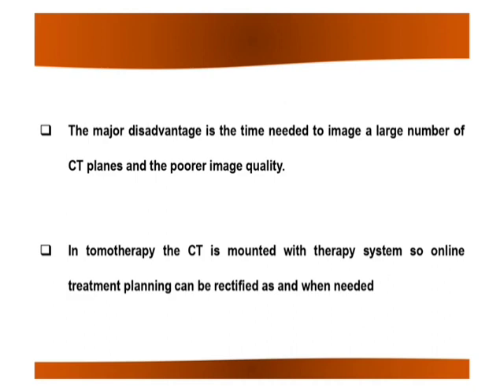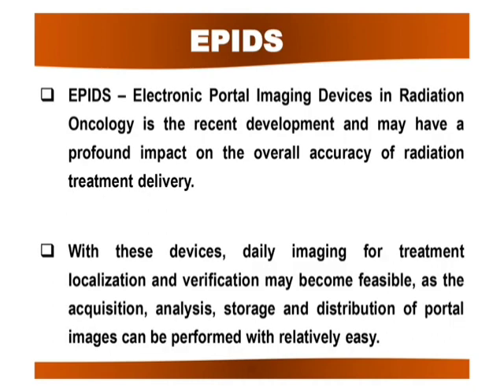procedures. You see here the modern linear accelerator with the EPID on it, so that when you give radiation, the dose which exits can be imaged here, and then you can see the tumor during the treatment and in between the treatment, the immobilization, because the EPID image is stored.